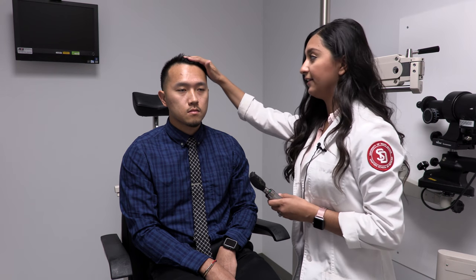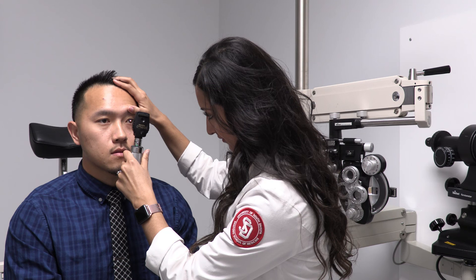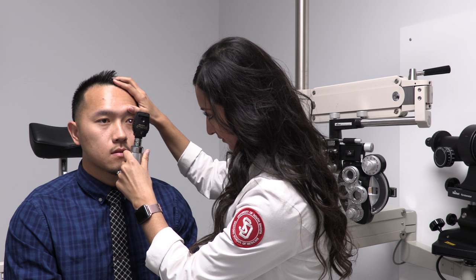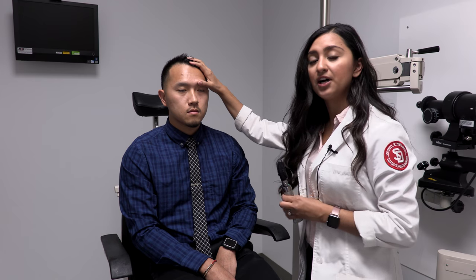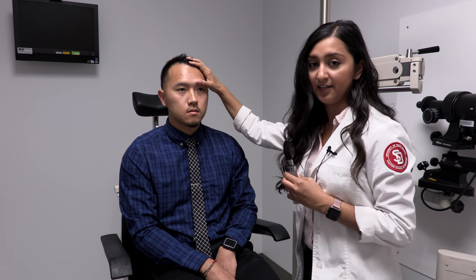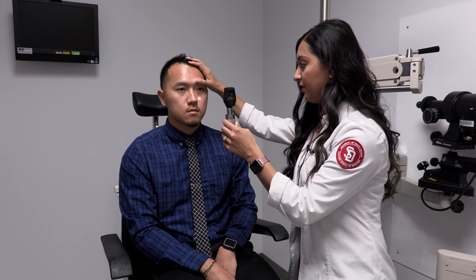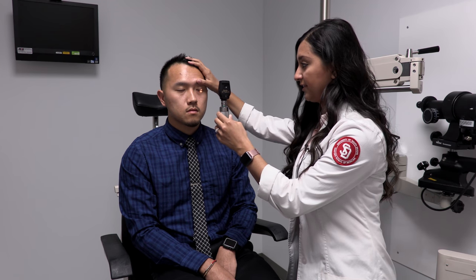Now you're going to want to place your hand on the patient's head and your thumb on the patient's eyebrow. Placing your thumb on the patient's eyebrow allows you to get as close as possible without running into the patient's eye. We're examining his left eye, so we're going to use our left hand and our left eye to examine the patient's left eye. You want to start at about six inches from the patient's eye and about 15 degrees from center.